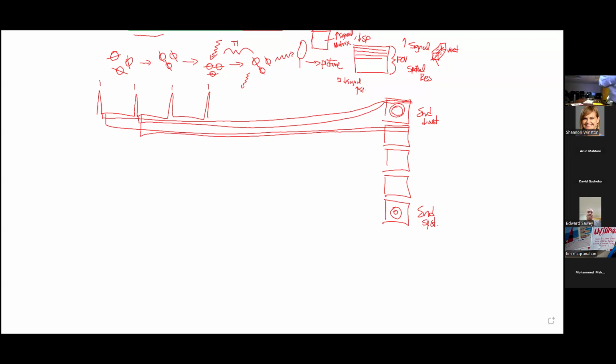It brought into the equation the time interval between these frames, which is the temporal resolution. So we always have three things to trade around: the signal, the spatial resolution, and the temporal resolution.